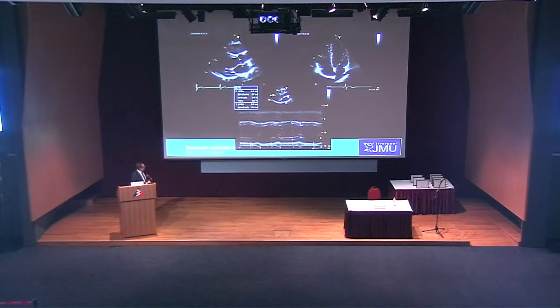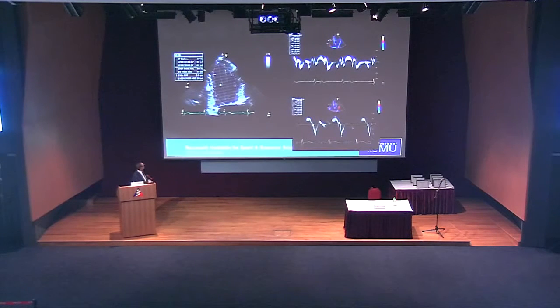If we're looking, we shouldn't really do this, but if we just look at fractional shortening, it's down at 26%, which is on the borderline of normal, or low normal, but we did an ejection fraction, and we did it Simpson's biplane, and it's coming out at 47%. The normal range now is 52%, and yet in this weird area where you're thinking, okay, is this normal, is this abnormal, is this a dilated cardiomyopathy?